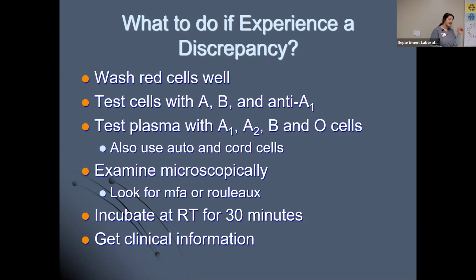But yes, I do have one FDA reportable error. Hope you guys never have to do that, but that was my one time mess up, an oversight. The blood bank is mandated by FDA, if you guys didn't know that. It's the one department of the lab that is regulated by FDA.